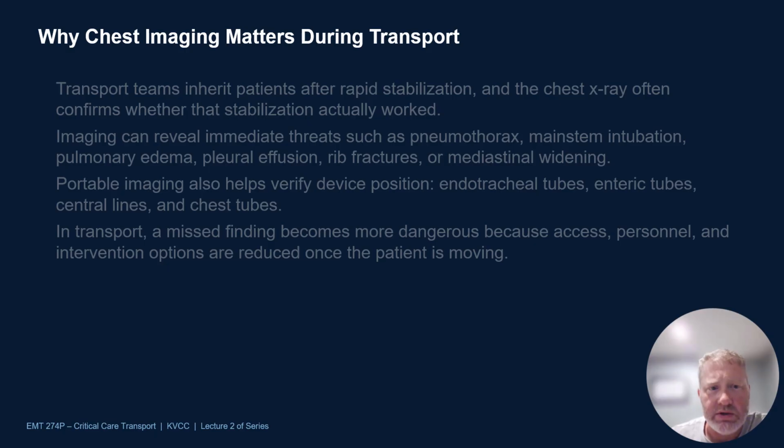Imaging is just a data point, though. It's not a substitute for assessment. A normal chest film does not cancel distress. A film that looks terrible does not matter until it matches what the patient is actually doing and what you're seeing on assessment. But still, there are several findings that absolutely change the transport planning and should not be ignored.